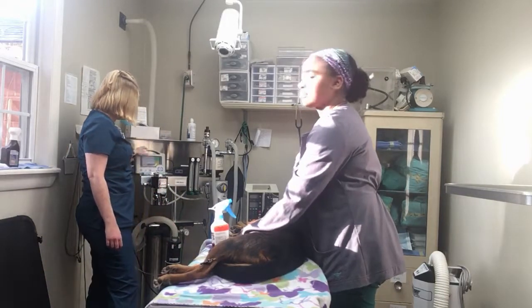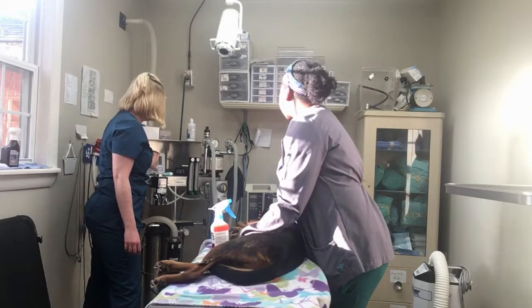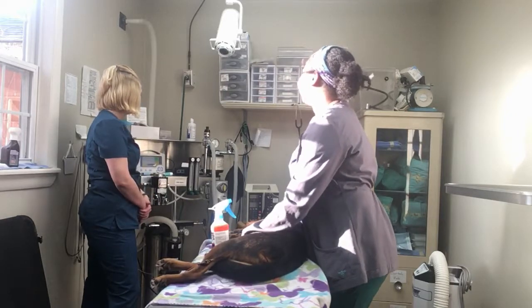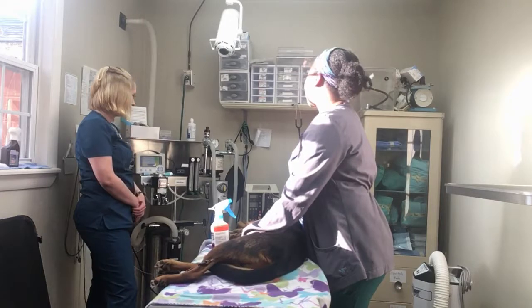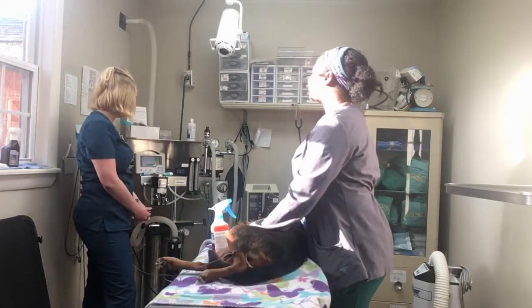Alright, so we've got it going over here, and I'm going to go ahead and start printing out. I'm going to let it run just for a little bit, just so that we can get a good solid reading.